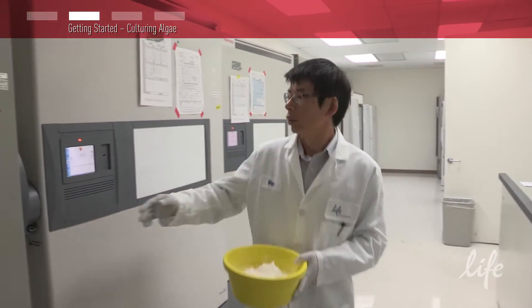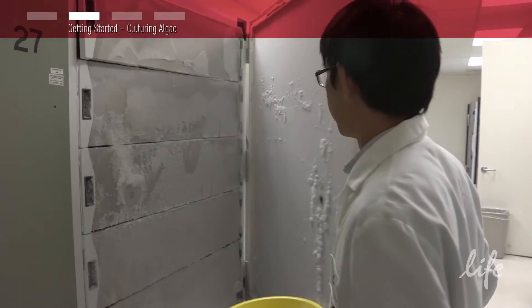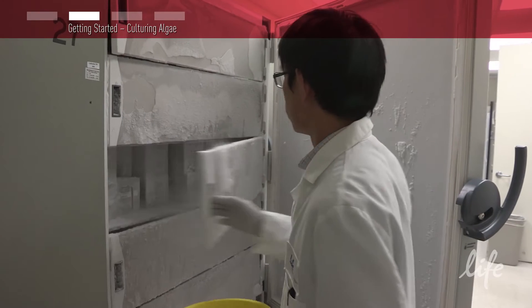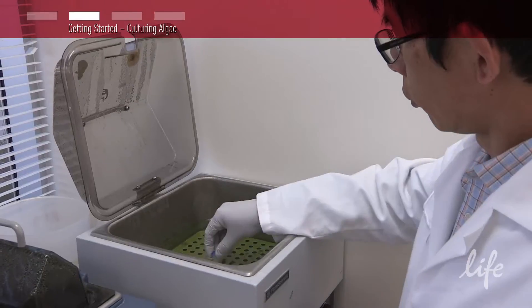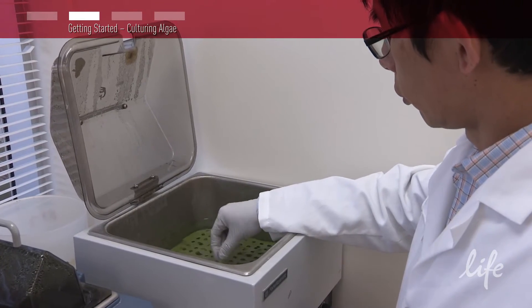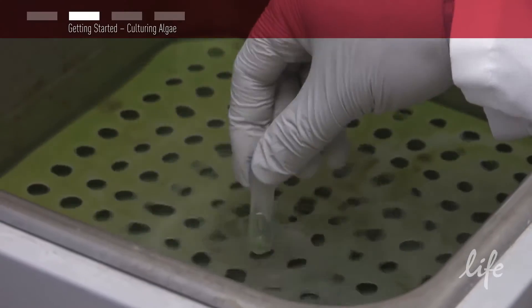The first step is to thaw your preserved strain. Collect dry ice and take this to your minus 80 freezer to collect your strain. Thaw by shaking in a 35 degree Celsius water bath for approximately 2 minutes.